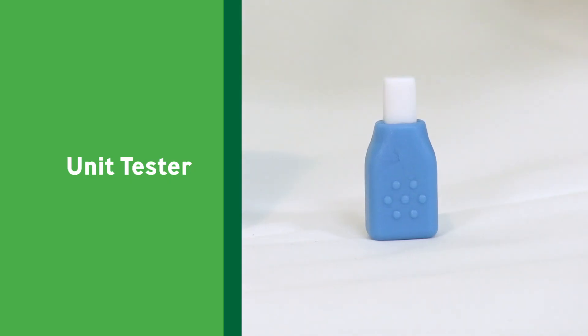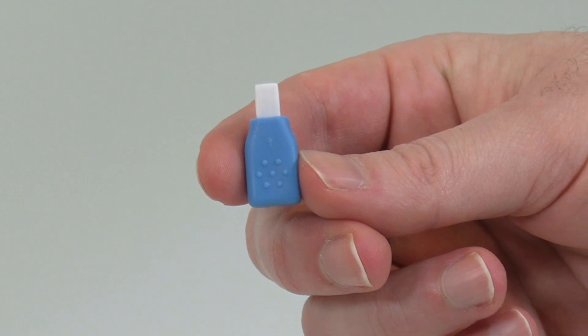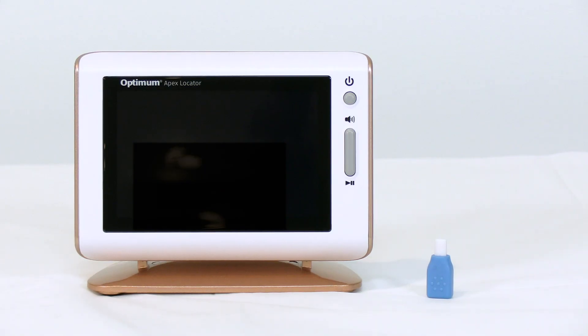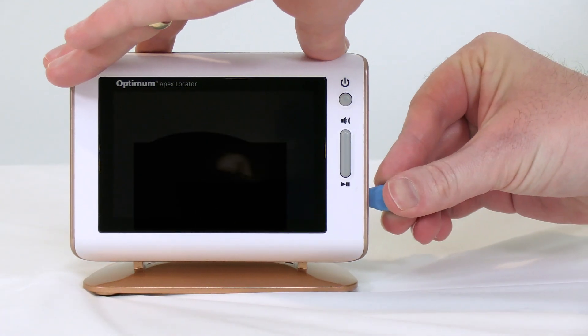Unit Tester. Using the tester, check if the device is in proper working order. First remove the measuring wire from the socket on the right side of the unit and ensure the unit is powered down. Next insert the tester.